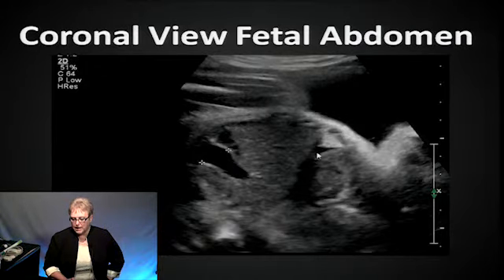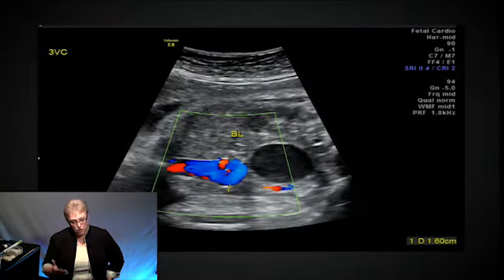Looking at a coronal again, looking at part of the heart, the diaphragm. This is the umbilical vein coming up into the liver. Look at this little area here. Remember, if there are measurements on it or if it's labeled or has numbers, it's something we want to look at. Look at the size of this compared to that. It's 12.8 millimeters. And then put color on.